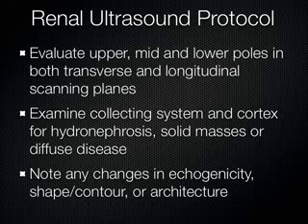All right. Now, when you look at the kidneys, you want to think about the upper and the lower poles, okay? The way I think about it is upper means towards the head, or superior, and the lower pole means down towards the feet, or inferior. And in between the upper and lower poles is the midpole. That's really all you got to know. You can look at them in their long axis, and then you want to flip the probe 90 degrees and look at them in their short axis.